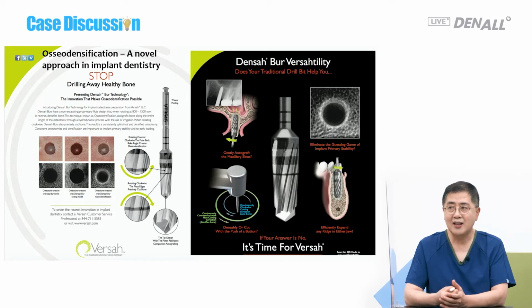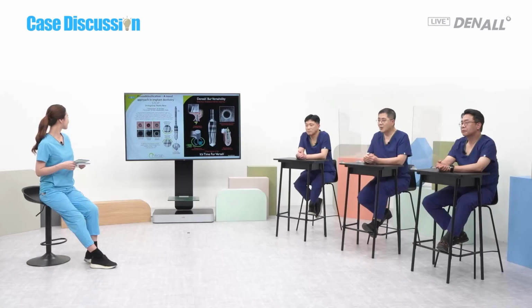This is a hot topic these days, which I have not used. This is a hot item for osseo densification. I heard it has versatile functions. I believe it can change bone from D3 to D2. In this particular case, I don't think this will be of great help.